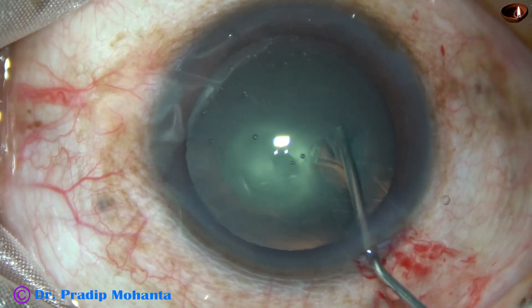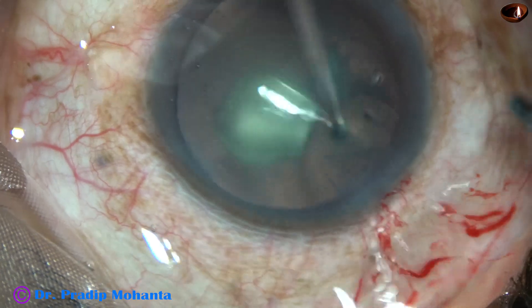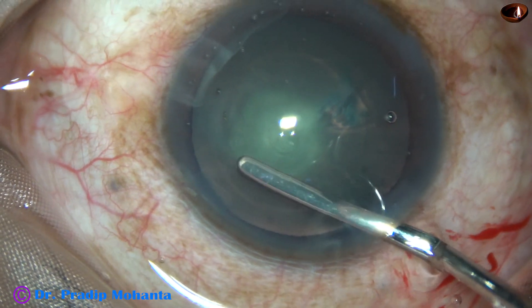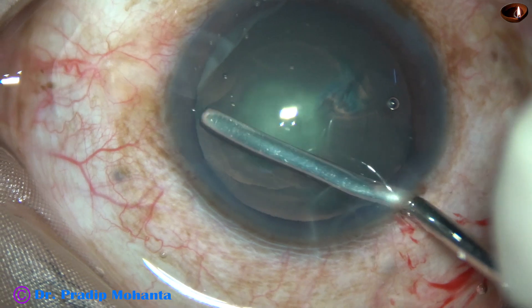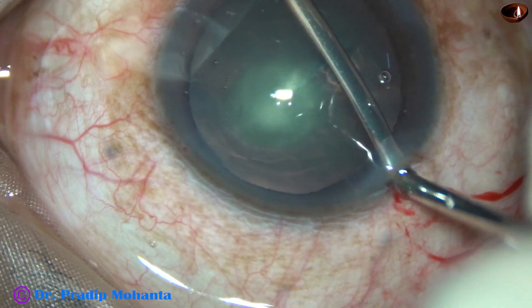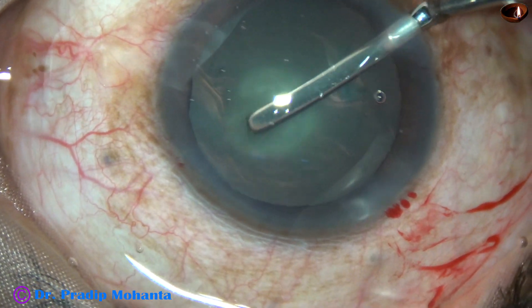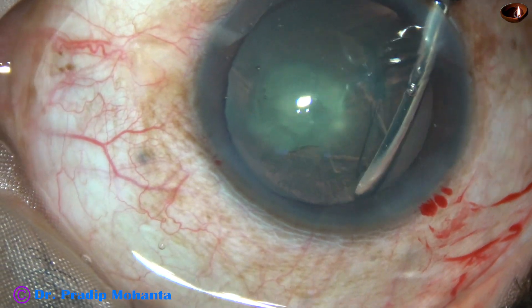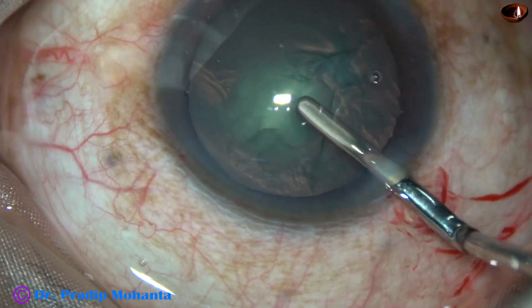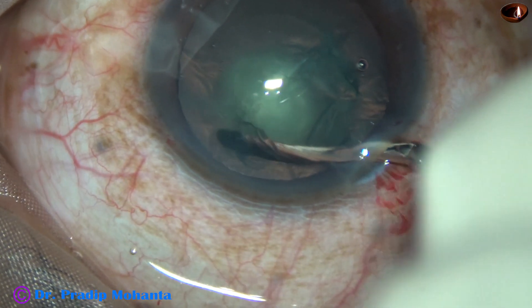Now, hydrodelineation — not hydrodissection. I did hydrodelineation, but at this time I didn't get a golden ring. I tried hydrofree dissection: from the rhexis margin up to the equator, I can separate the cortex and the capsule with the help of an iris spatula. The superior cortex can be separated going through the side port. I tried to scoop out the nucleus, but I failed.